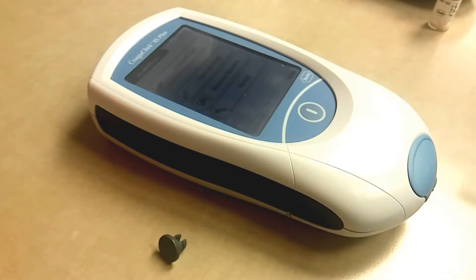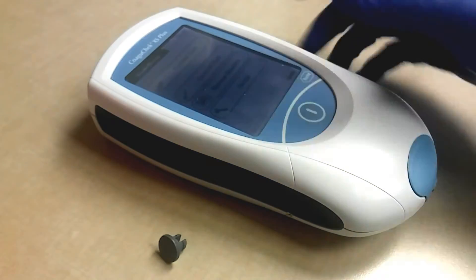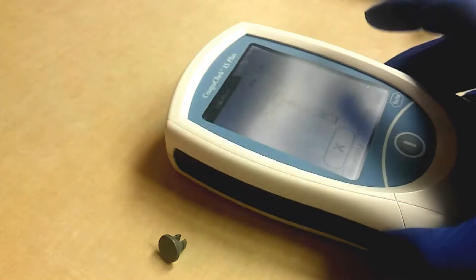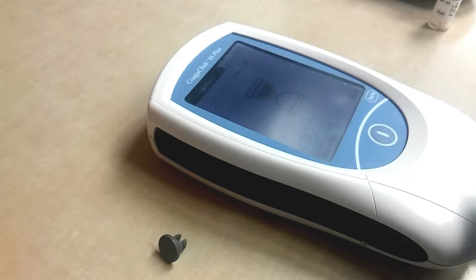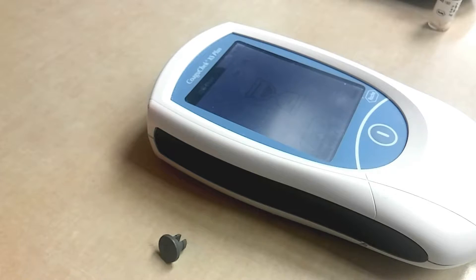Now that's done, you want to write that in your QC log. Then we're going to click on Control Test again, and it wants the strip so we'll put that in. We want 208 and then we'll click Level Two this time.